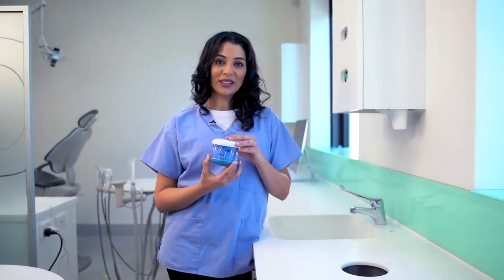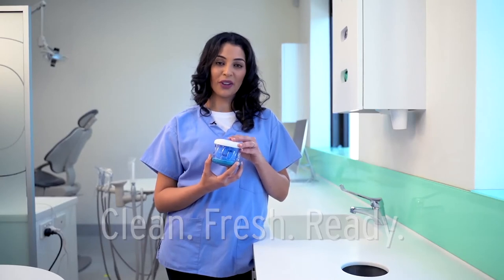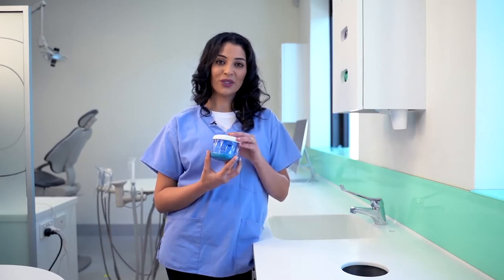Now that your dental appliance is clean, fresh and ready to use, you can pop it straight back into your mouth or leave it safely stored in your Dr. Marks Hygiene until you need it next.